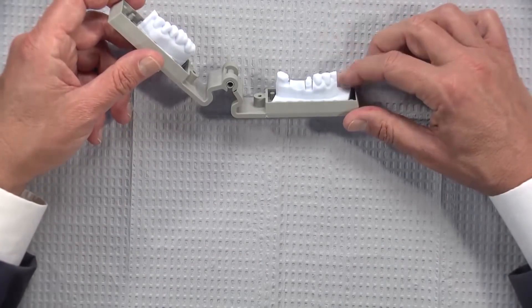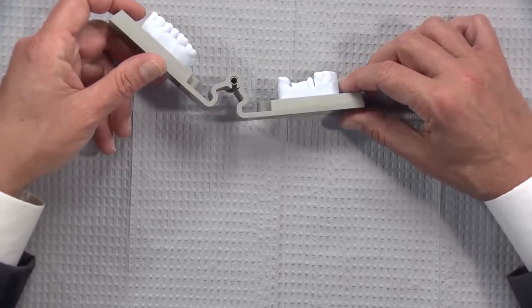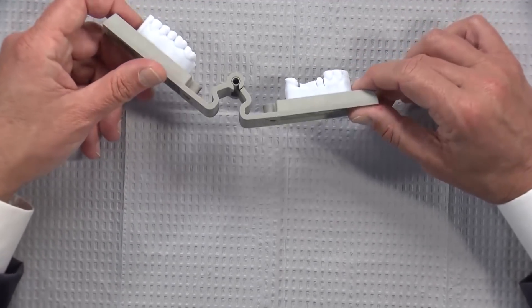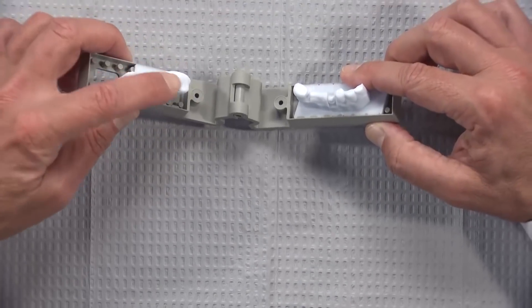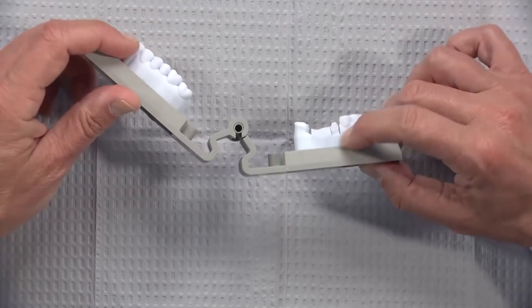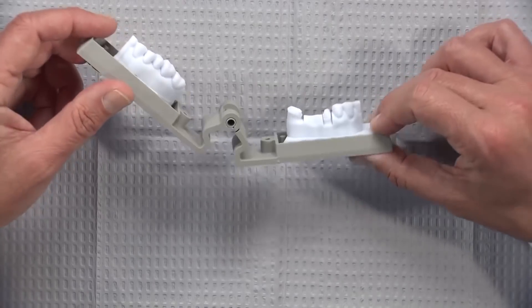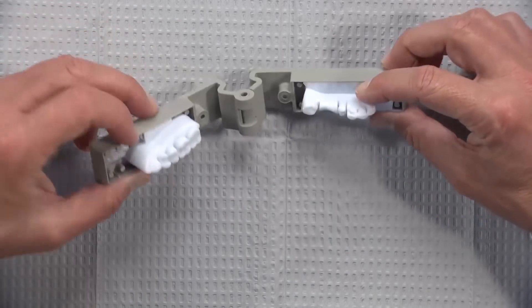This is what an SLA model looks like that you would receive from a 3M trusted partner. This is printed on a 3D printer. Unlike maybe the Cadent model if you've seen those, they're kind of big and heavy models that are milled from polyurethane.